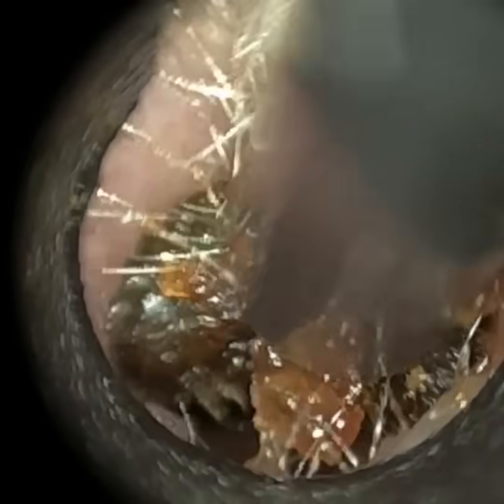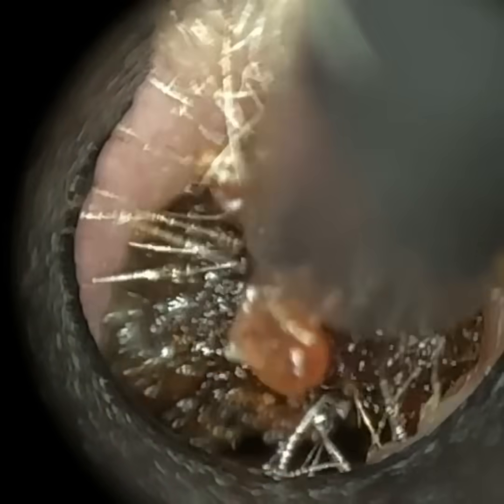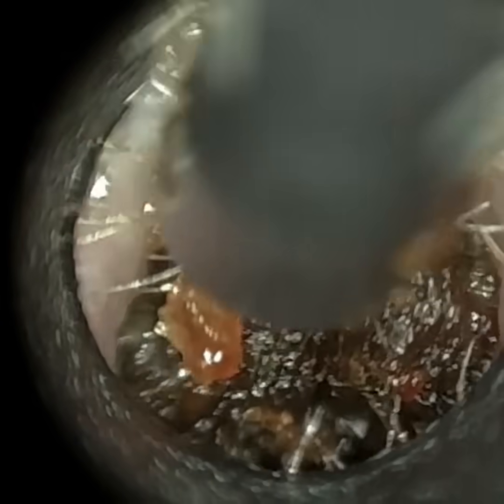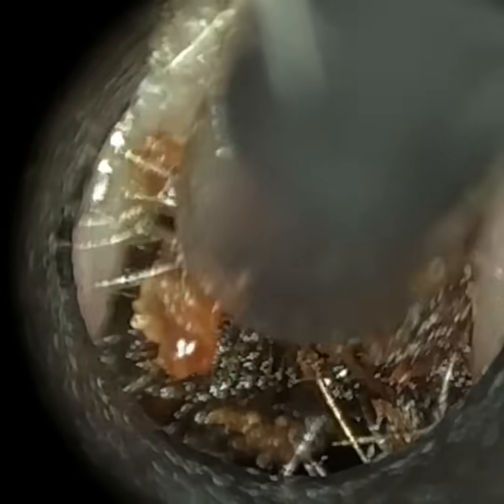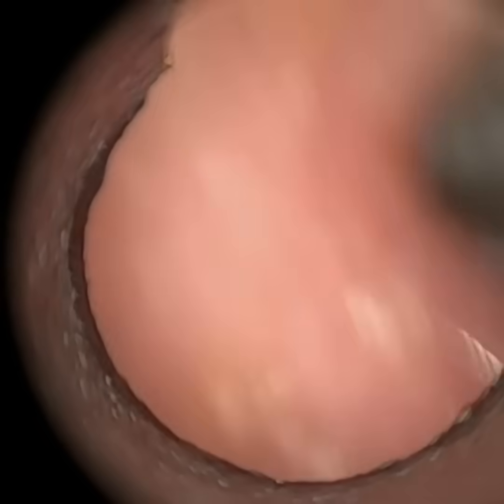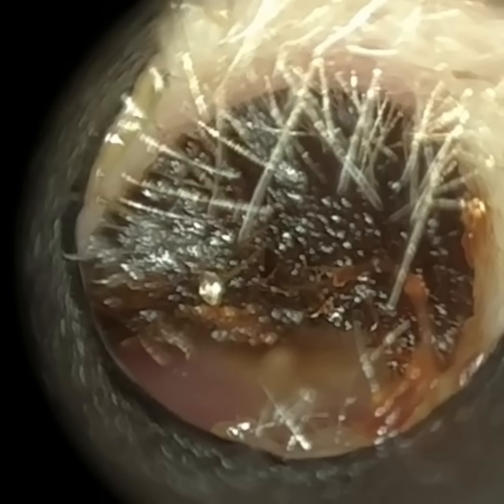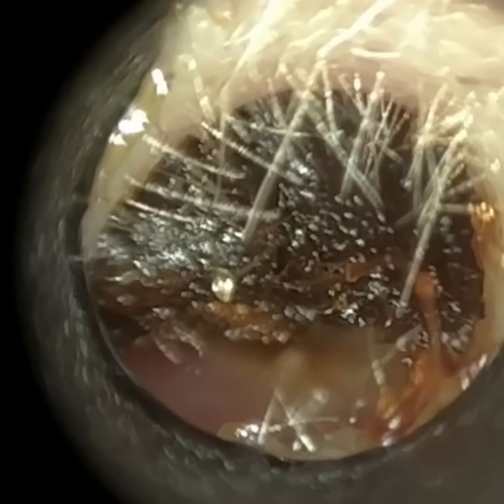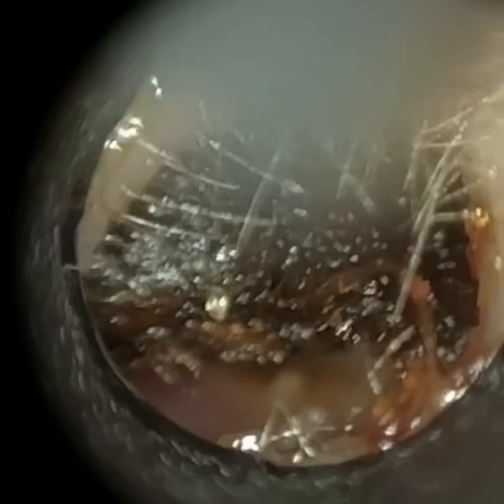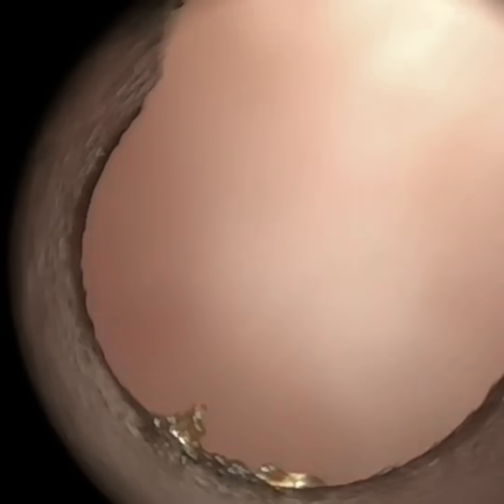So I did it in two ways. We played a sound with the tuning fork, positioned it on the patient's forehead, and I asked them to tell me which side they could hear it, or if it was in the middle, and they could hear it from their worst left ear. So think about your eardrum like a two-way door. It allows external sounds in, so you can hear them, but it also allows your internal sounds to escape, so you can't hear them. With the tuning fork, when we place it on your forehead, it's vibrating your skull, and these vibrations are transmitted to the organ of hearing. So that's an internal sound.